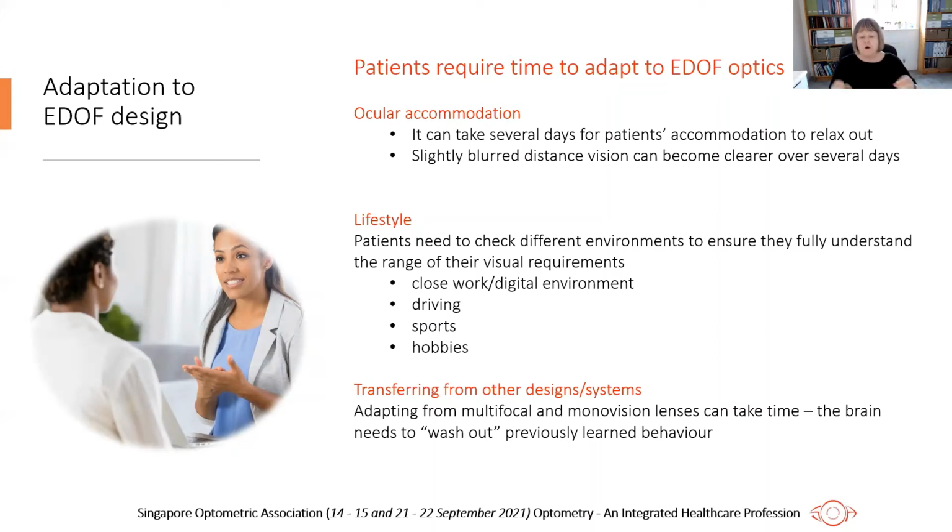Also, if you've got other designs or systems like multifocal and monovision, the brain has to wash all that out and get used to these types of optics. They are different from normal visual experiences.